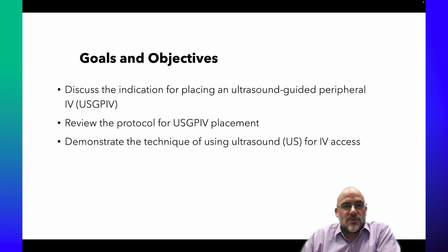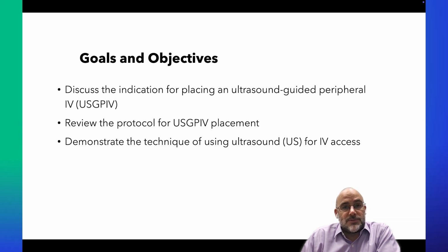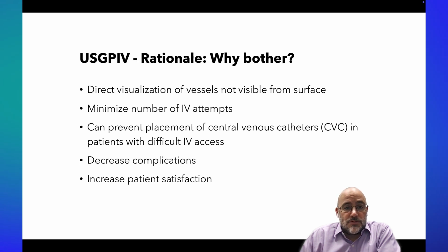We'll go ahead and begin with some goals and objectives. The primary goal, of course, is to discuss the indication of placing an ultrasound-guided peripheral IV. I'll refer to this as the USGPIV. We'll review the protocol for placing IVs with ultrasound guidance, and then we'll also demonstrate the technique using ultrasound for IV access. Let's talk about why we're doing this at all.